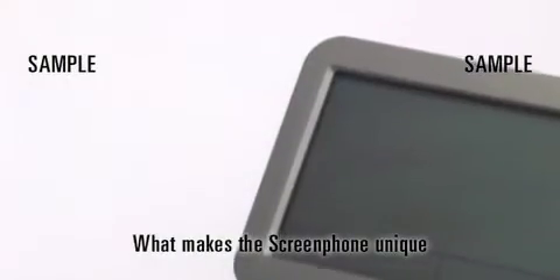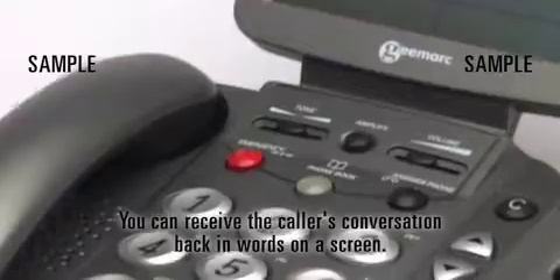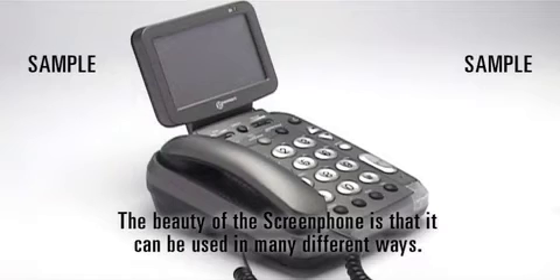What makes the ScreenPhone unique is that you can speak your part of the call as usual, but at the press of a button, you can receive the caller's conversation back in words on a screen. The beauty of the ScreenPhone is that it can be used in many different ways.